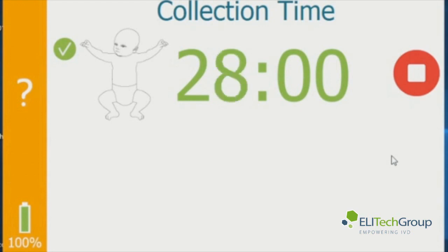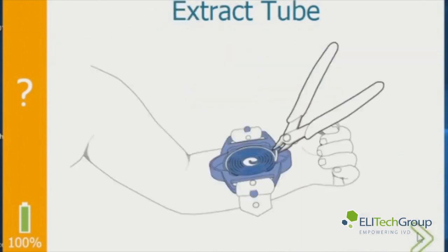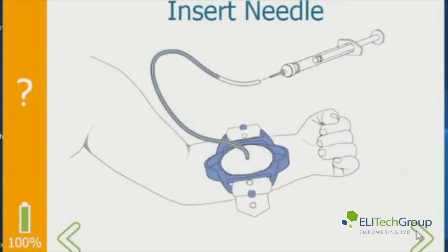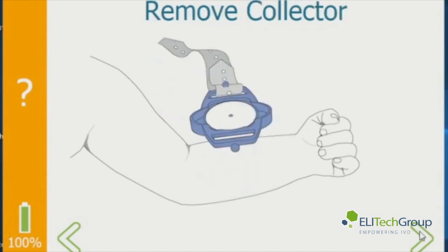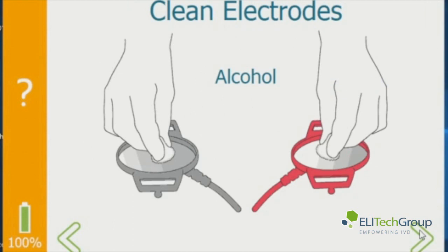At the end of 30 minutes you stop the test. Lift the outer tubing winding and pull it up so you can see the level of the sweat. If the sweat is above the top mark, you've got plenty of sweat for the test. Insert the needle in the end of the tubing with it pulled back halfway before inserting. Then cut the tubing off and remove the collector. Wipe the skin with DI water again, then clean the electrodes with alcohol.